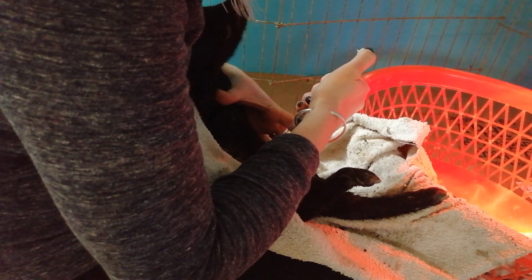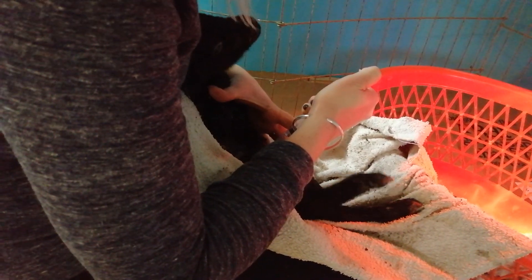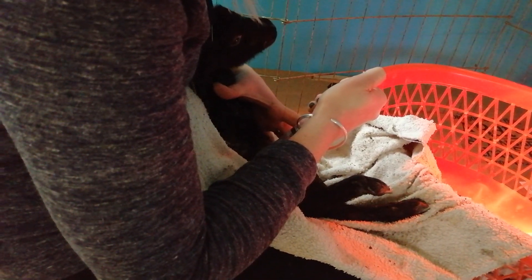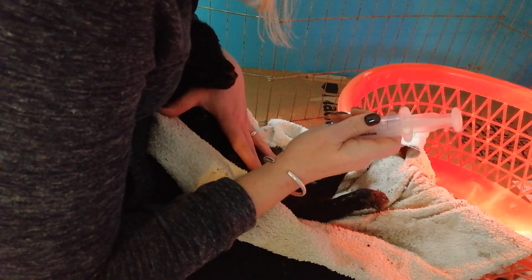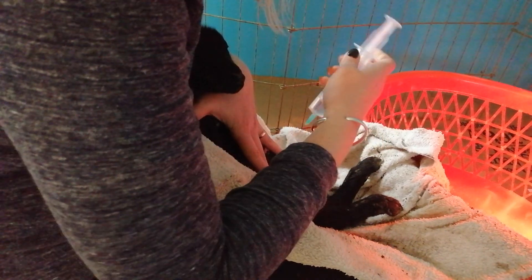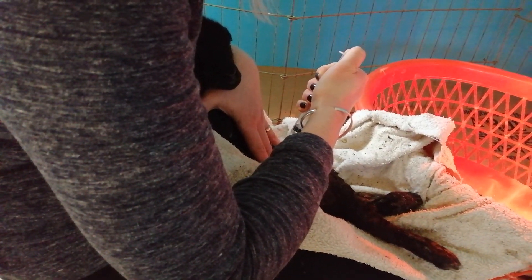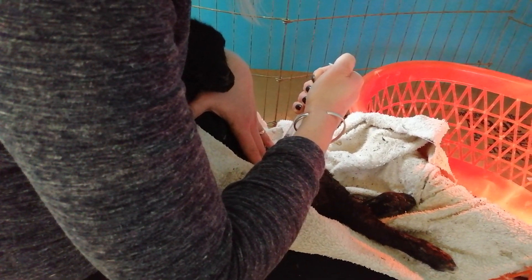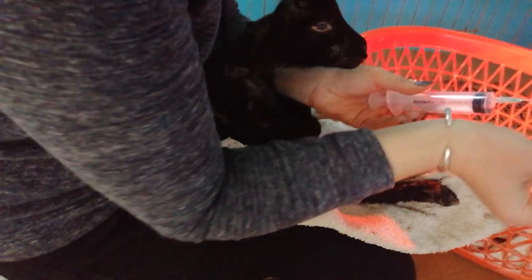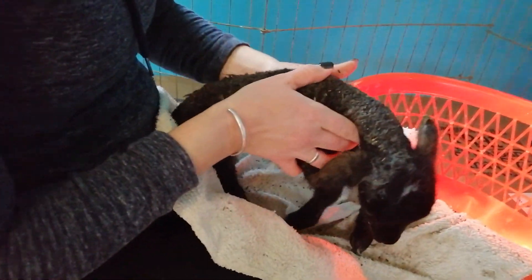Okay, I'm just going to stick that baby in — and away we go. You don't even feel that hardly, do you? Let's go, little sweetie. That's a good girl. Okay, easy peasy. Oh, look at how lively she is! She's not standing yet but she's much better than she was 45 minutes ago.